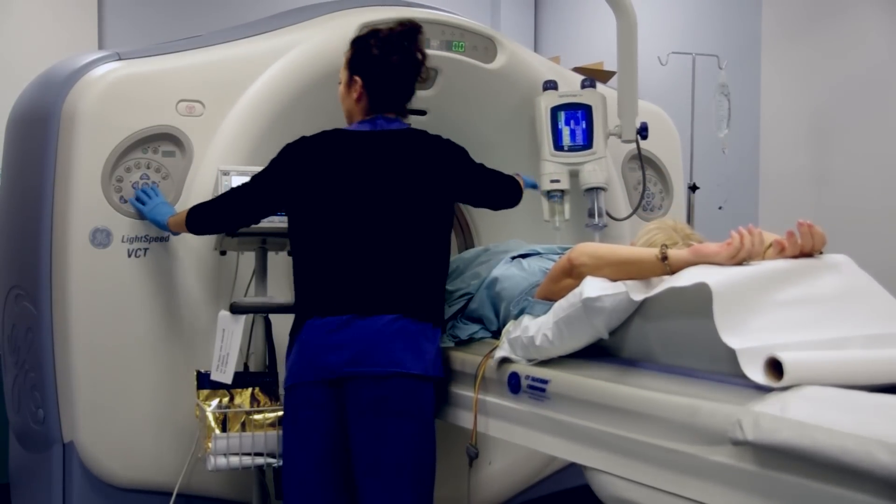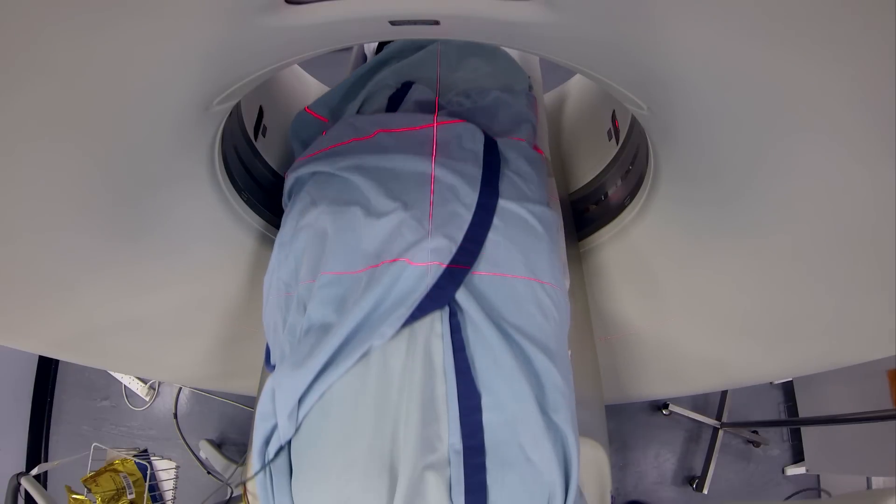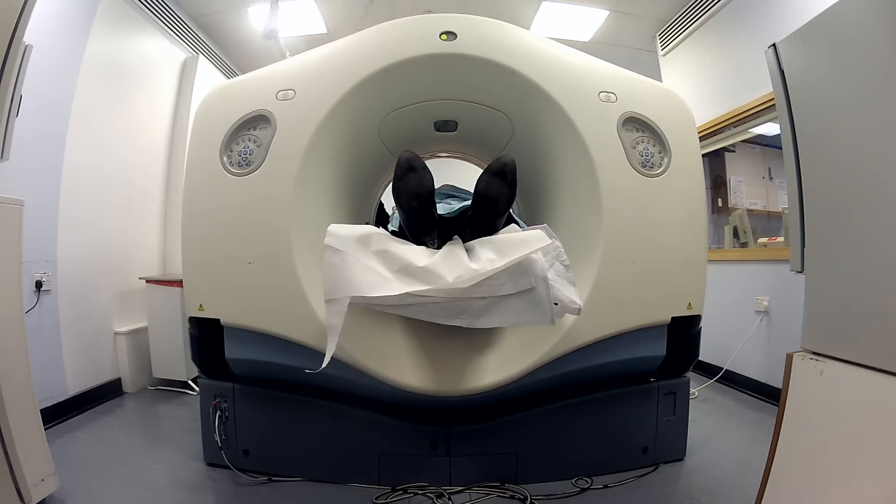You'll then be connected to the x-ray dye. You'll move in and out of the scanner a few times for some planning scans. The machine does get slightly noisy — it's just a motor spinning around, nothing for you to worry about.